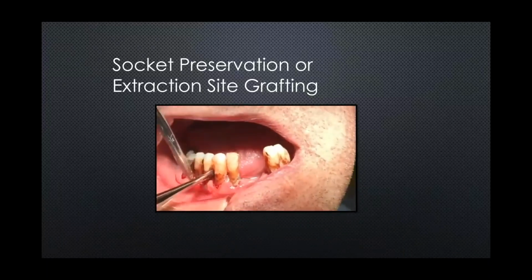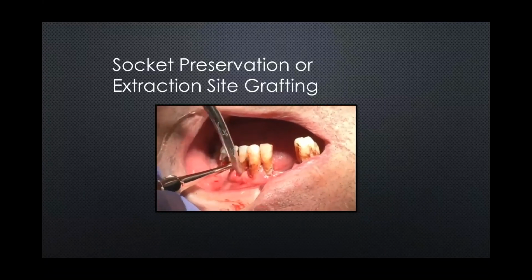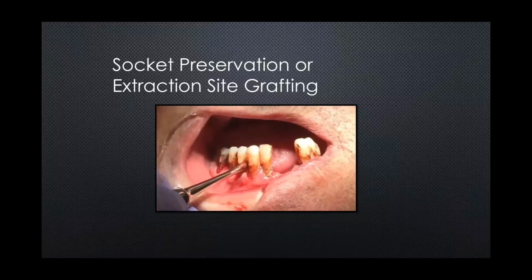We'll elevate the tissues. Of course, here we need our throat pack. We start to elevate our teeth, and we do that gently across that area.